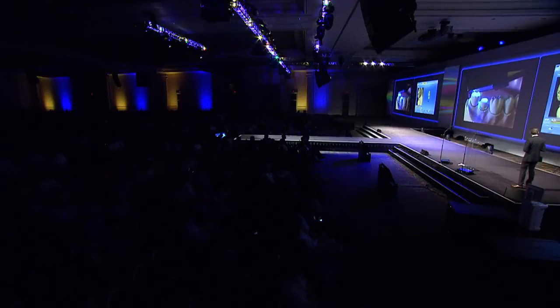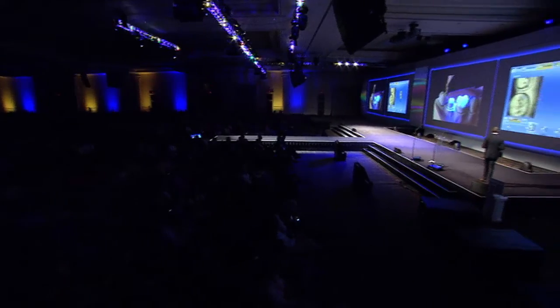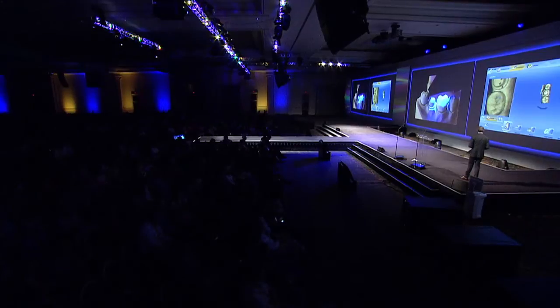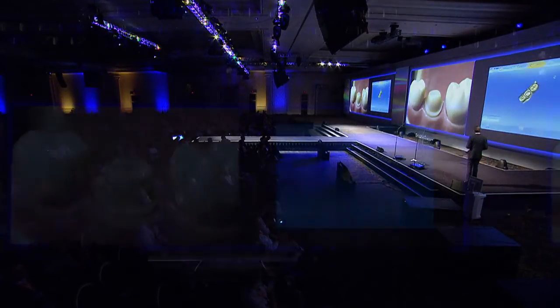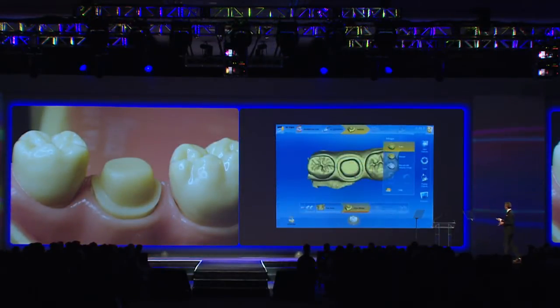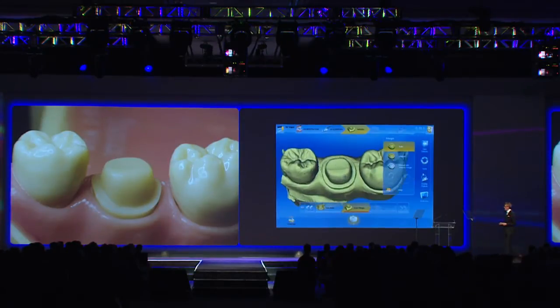And then after doing several optical impressions, minimum one, better 5 or 6 or 7, a 3D model is calculated by the software. You can see the preview, and then the calculation of the 3D model. You're used to this situation, but it's monochromatic, there's no color.